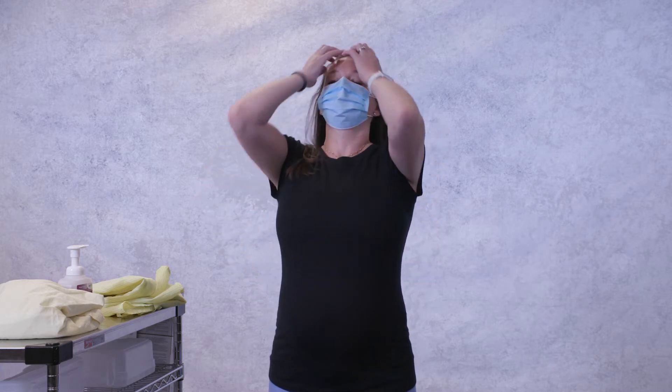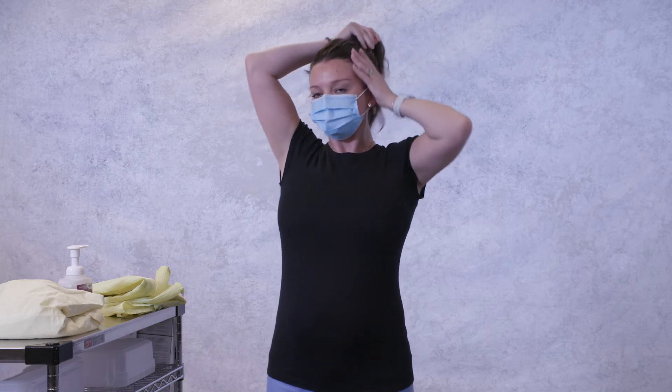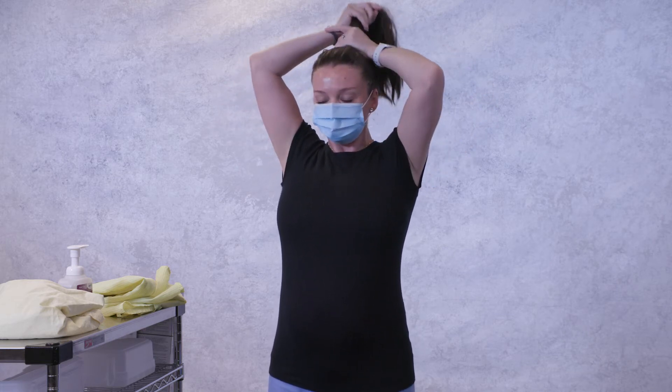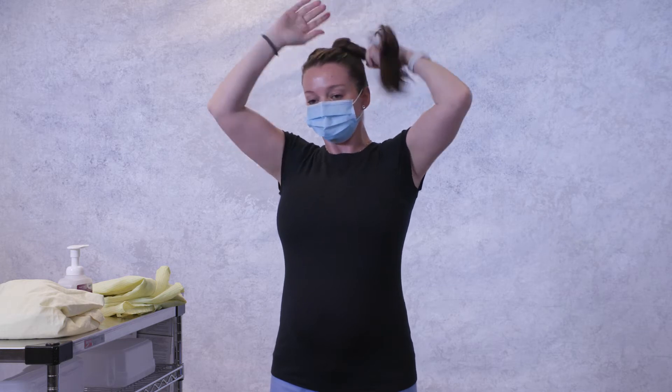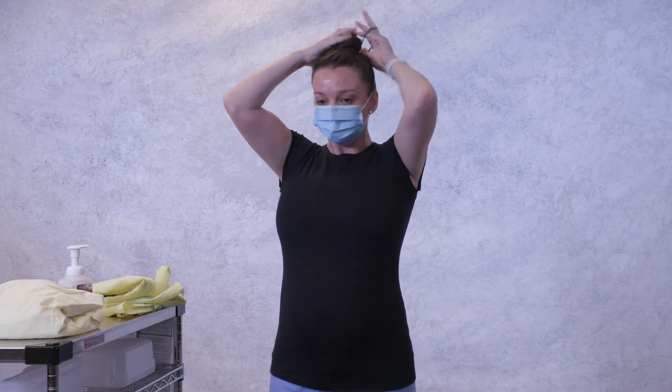Another best practice is making sure that hair is secured and out of the way. Once PPE is donned, keep your hands away from your face and hair and limit surfaces touched. Equipment should be dedicated to the patient whenever possible. Leave items such as personal stethoscopes outside the room.